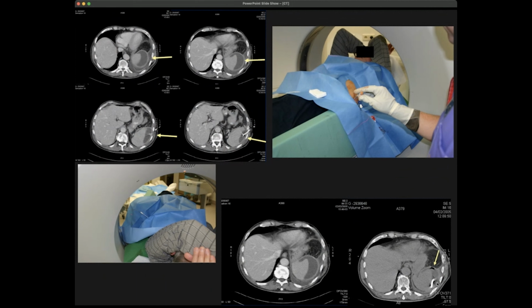They take this fluid out, and bring it to the lab, of course, to see whether this is malignant. So this is both therapeutic, to get the liquid out, and secondly also diagnostic, because then you can do microscopy of the liquid. Just like I showed you last time with ultrasound, you can do a biopsy. You could actually also do it guided by CT.